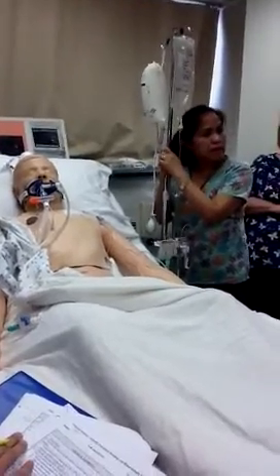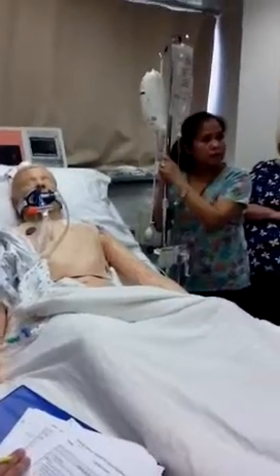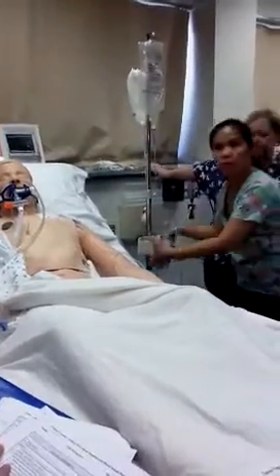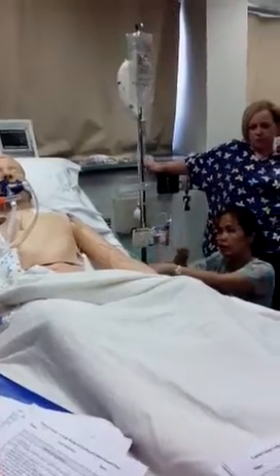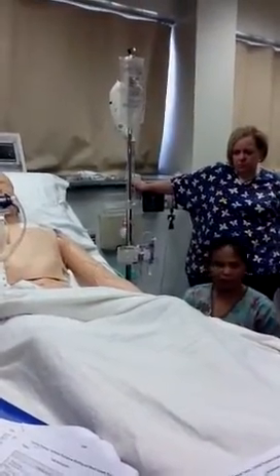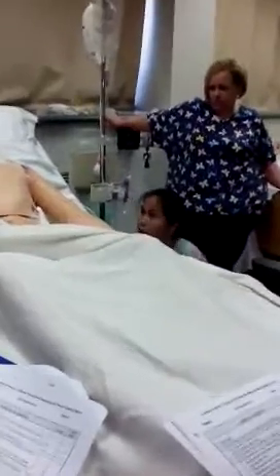If it's contraindicated for them to have, let's say, increased ICP, you might have to, but you still level it here. So if the patient's head is down, then this will probably come down some more, but you have to level it at that point. If the patient's down, this has to come lower.